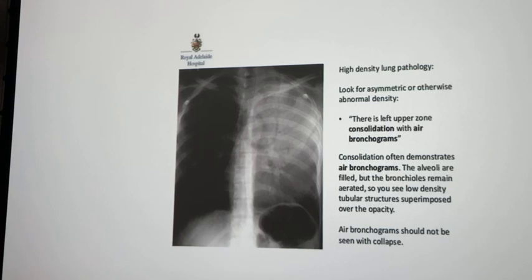That's what happens whenever you're phototiming and you put something over the photocell that shouldn't be there, basically. So in this case, your machine is expecting a chest x-ray and you utilize the outer two cells, and this one had to run continuously for a while until it got the right density, which burned this lung out, right?